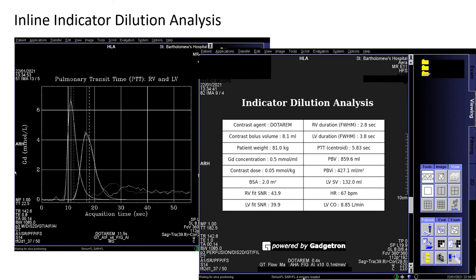Approximately one minute following the completion of the REST perfusion scan, an automatic report is generated summarizing the indicator dilution analysis, which includes the PTT, pulmonary blood volume, and cardiac output, and also includes quality metrics for the goodness of fit for the concentration curves.